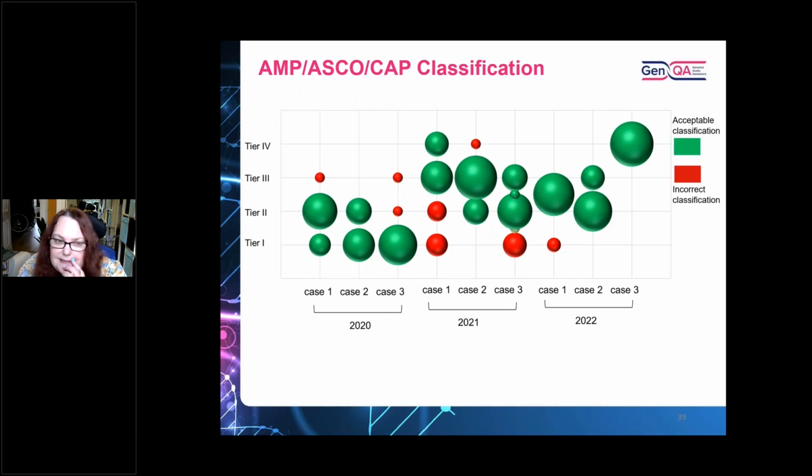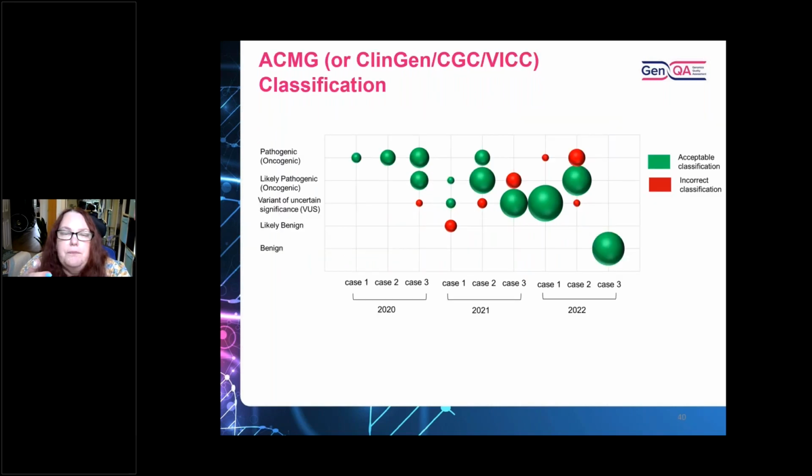So next slide, please. We also looked at both the ACMG guidelines, to determine whether something's pathogenic or not, and the new guidelines that were produced in 2022 from Horak et al., which were about oncogenicity and are on a similar setup to the pathogenicity guidelines. And again, for pathogenic, likely pathogenic, VUS, likely benign, we saw quite a lot of variation in whether something would be called likely pathogenic or a VUS.